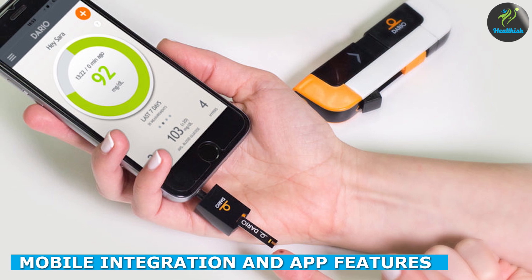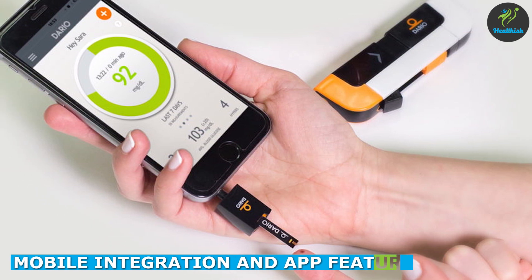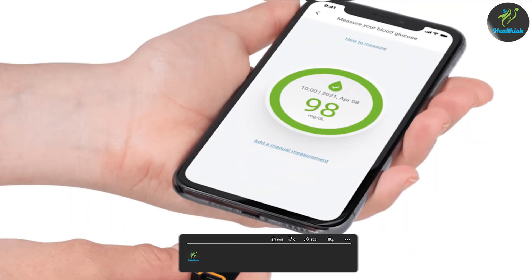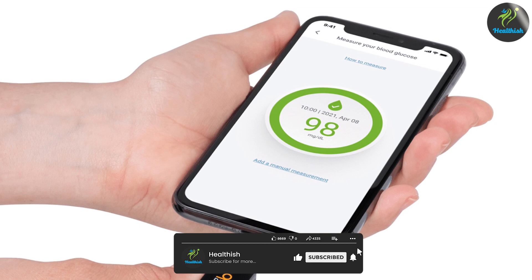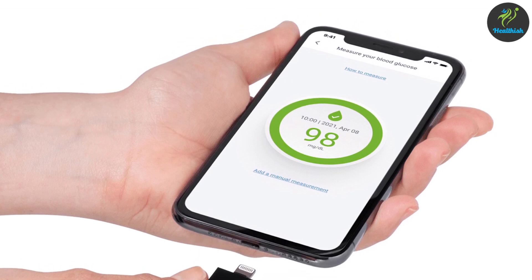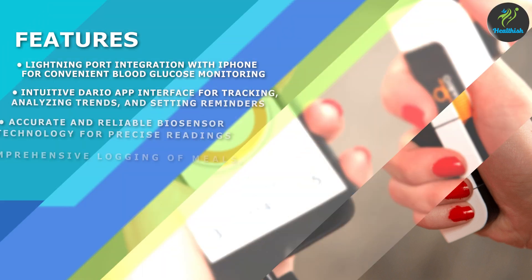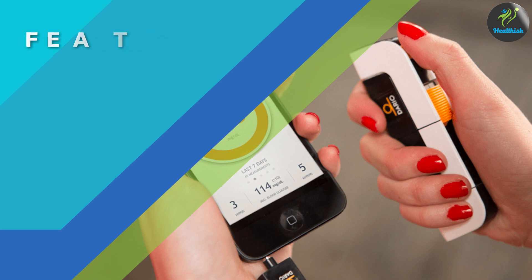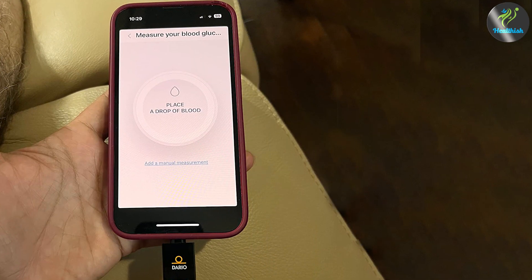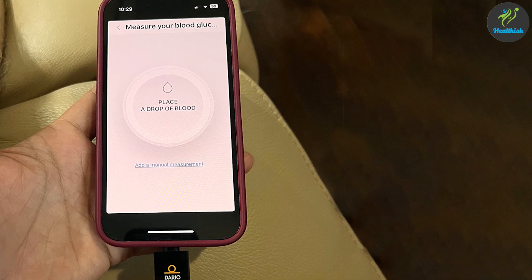One of the standout features of the kit is its integration with your smartphone. By simply plugging it into your iPhone's lightning port, you can turn your phone into a powerful blood glucose monitor system. The accompanying Dario app provides an intuitive interface for tracking your glucose levels, analyzing trends, and setting reminders. The app also allows you to log meals, medications, and physical activities, providing a comprehensive overview of your diabetes management.